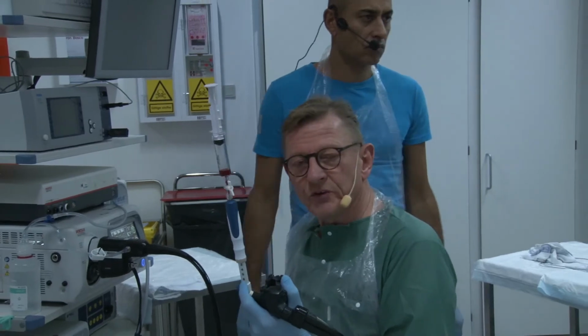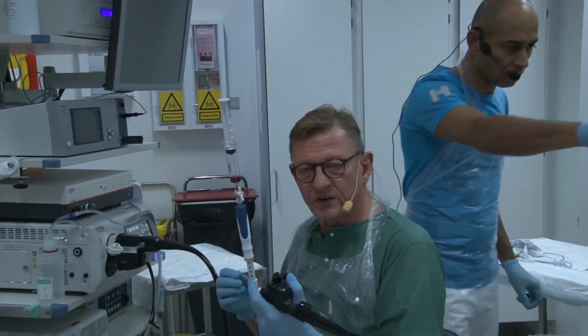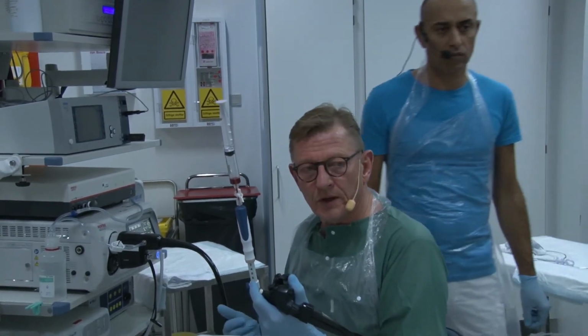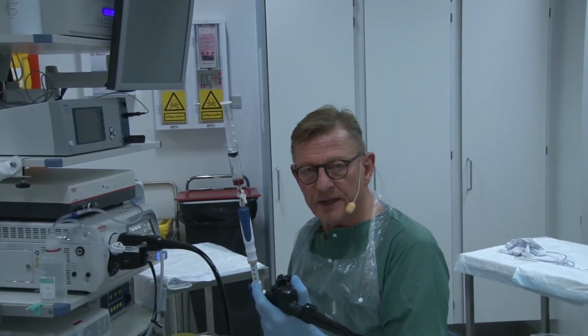Peter, I have one question. If the pancreatic duct is interposed, so that you have to cross the duct to reach this lesion, is this a contraindication or not? Usually this is what people say. On the other hand, we also do microbiopsies of main duct IPMNs.